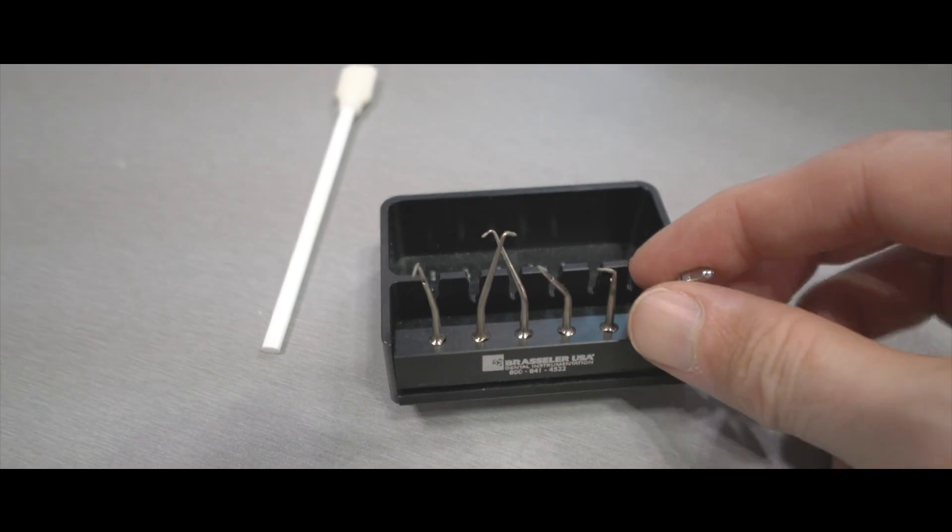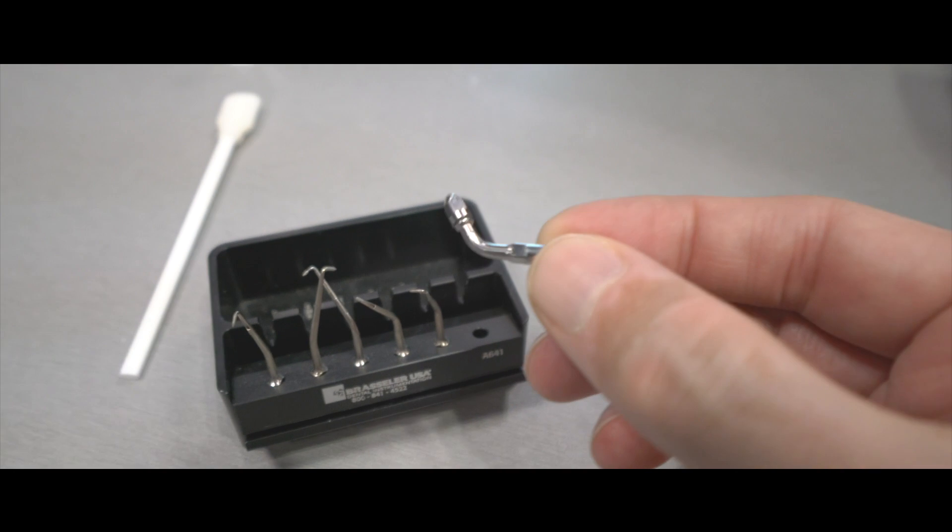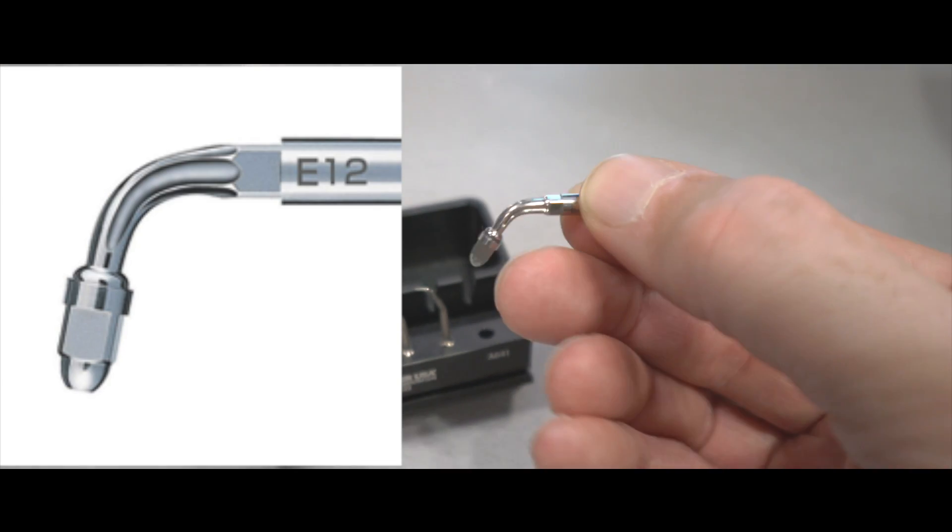Absolutely. So if you have a separated instrument and the case is sent to me, what I like to do first is take a small U-file — like a 15 or 20 U-file — place it into the adapter. I prefer usually the right-angle adapter, which is the E12, then use the water on it. I go into the canal, depending on the location where it's separated, and slowly, on a very low power, try to go around that file in a counter-clockwise direction to loosen it with a little water.